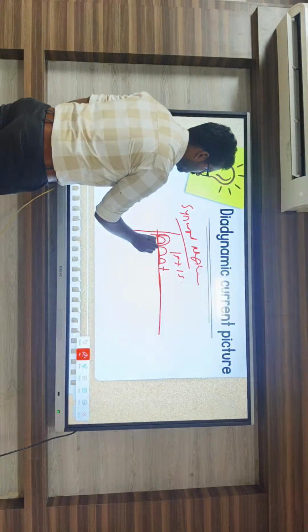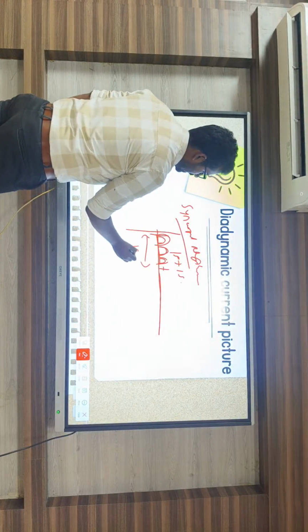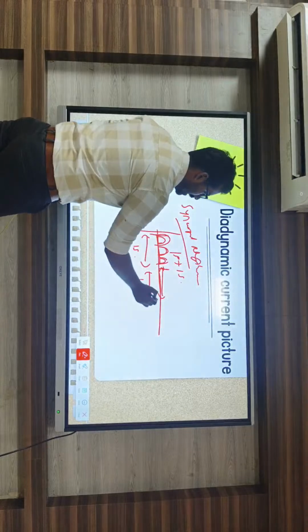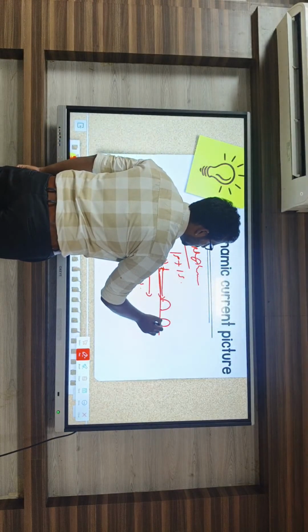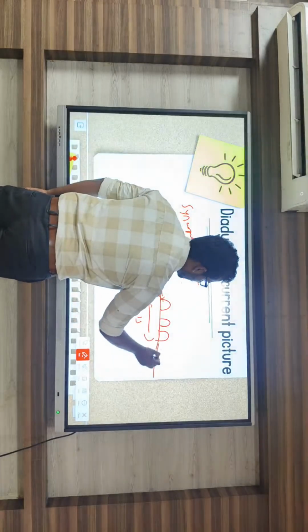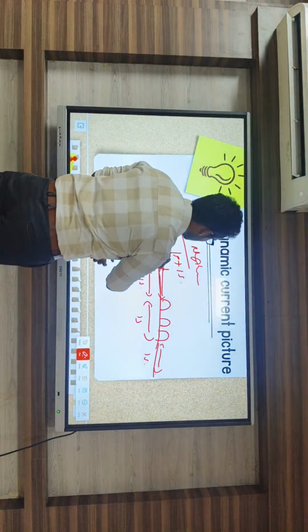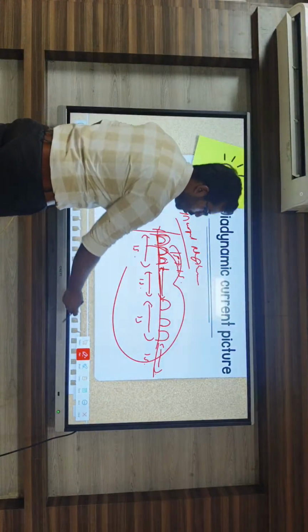This is the fixed monophase, for 1 second, and the resting period, that is the half period, is 1 second. And again after this, it comes back to the fixed monophase, that's also 1 second, followed by a resting period of 1 second. From the start of the treatment duration to the end, the same combination keeps repeating. So this is the syncopal rhythm.